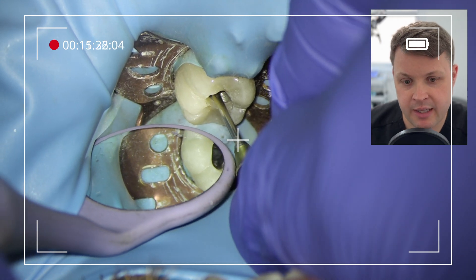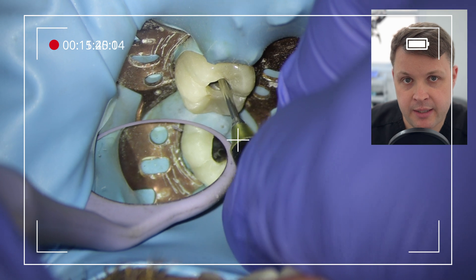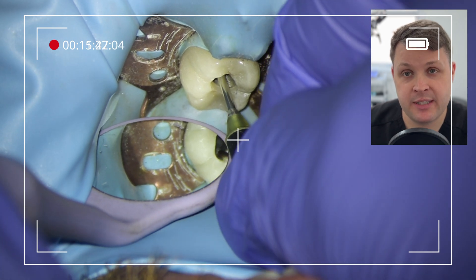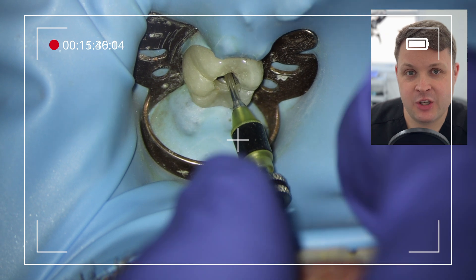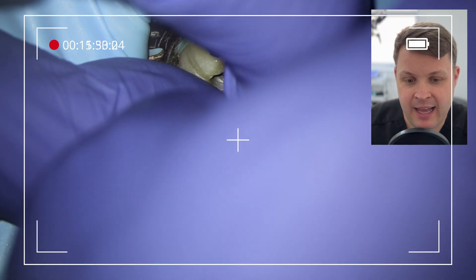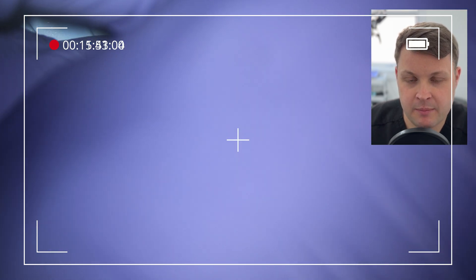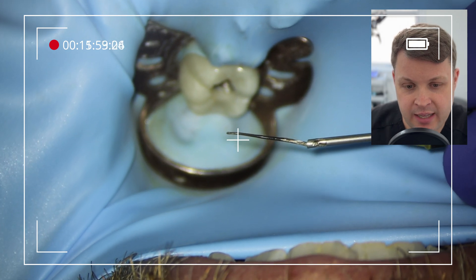I'm getting a good feeling from this. I feel like the IRS system is pushed down quite significantly, and this indicates that the silver point is poking through that window much more. I give it a good tighten up — remember it's left to tighten — then a tiny little wiggle, a bit of a tug, and then we push it out. And there we have it: this is the first silver point.